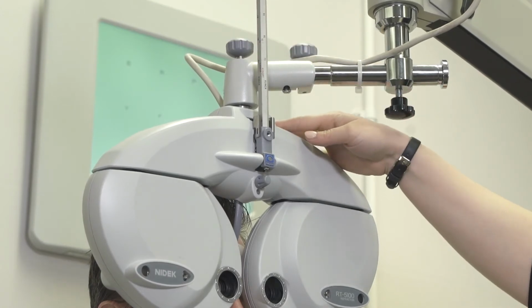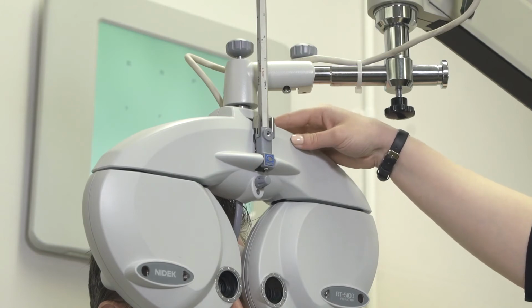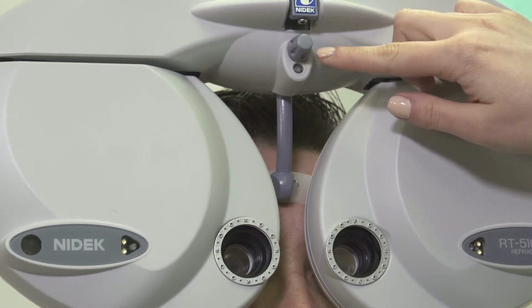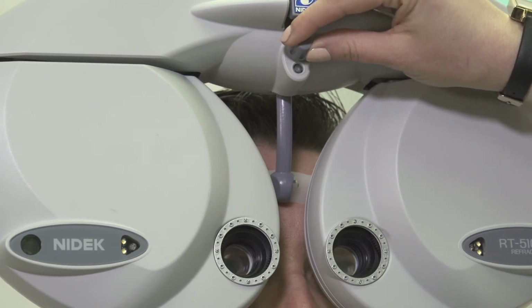Along the side here we have a small spirit level to get the device as lined up and level as possible. When the patient's forehead is in the correct position, the blue light at the front here will go off, and we're able to adjust the position of that forehead rest using the small grey knob at the front.